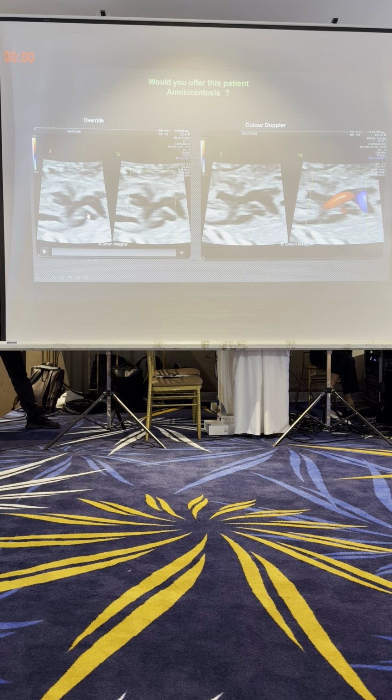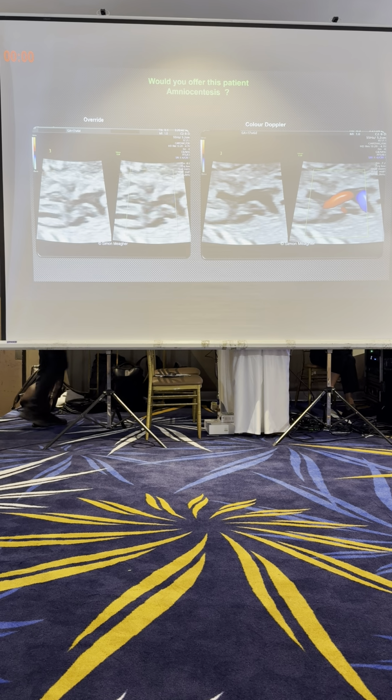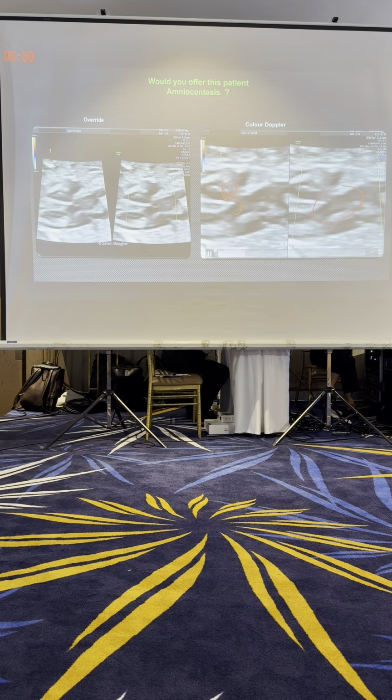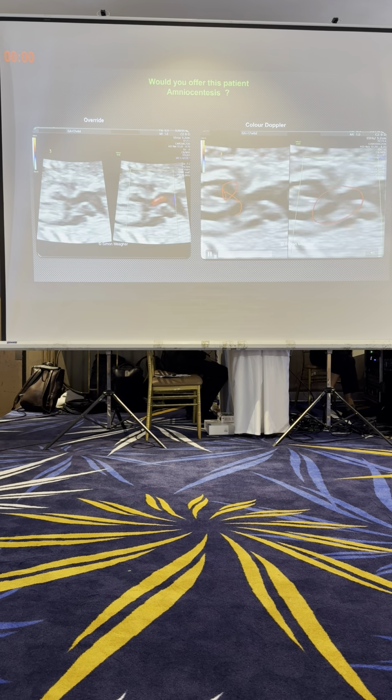Because it's very easy to make a normal baby look like tetralogy of Fallot if you take an oblique left ventricular outflow tract view. Look at this baby. Do you think this baby has tetralogy of Fallot? No, this baby does not, because the section you're taking for the LVOT is abnormal. Also, there's no wash of color going across here. This is not correct, you need to be very careful. You take an oblique LVOT view.